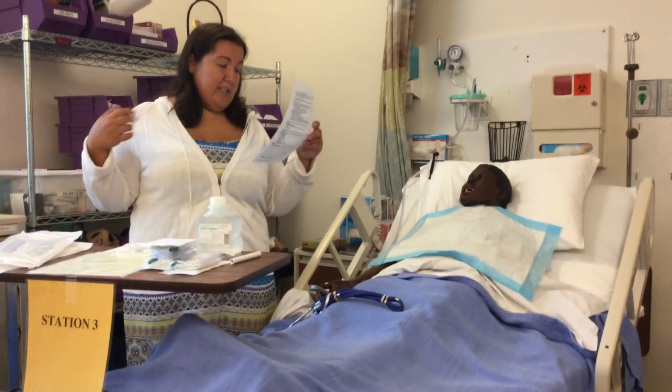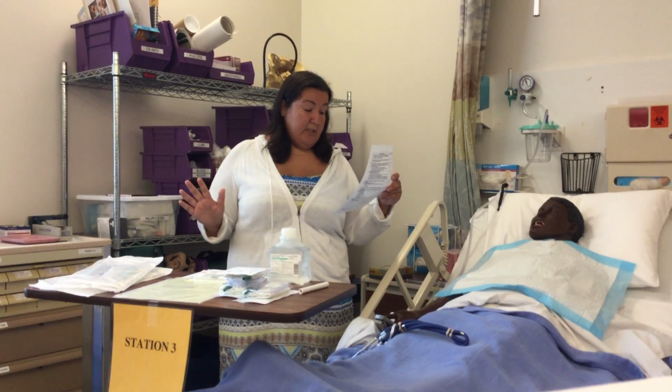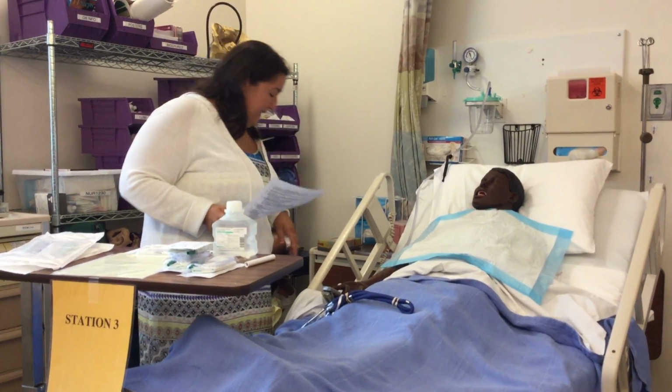So you want to make sure that you wash your hands. You want to make sure that you have their call light in reach, identify yourself, privacy, all that stuff. Tell them what's going to occur. So you want to tell them, I'm going to be suctioning your nose and your mouth. It could be uncomfortable because it's not going to be the best feeling in the world. Put them to a comfortable height.